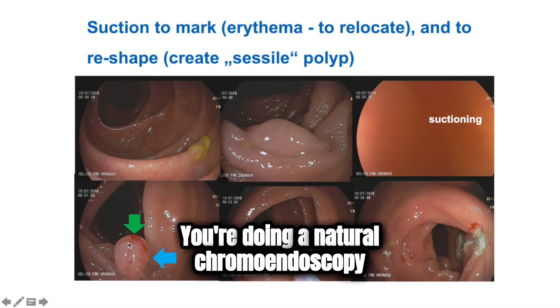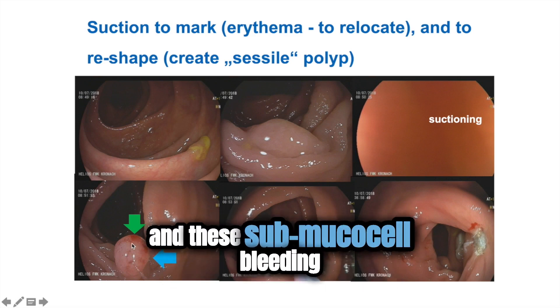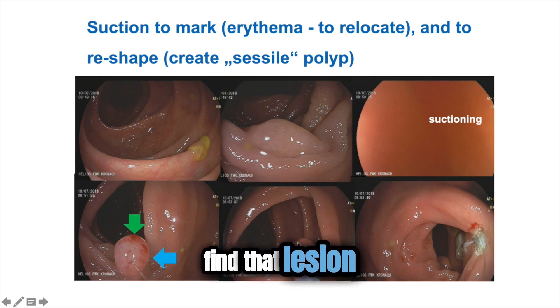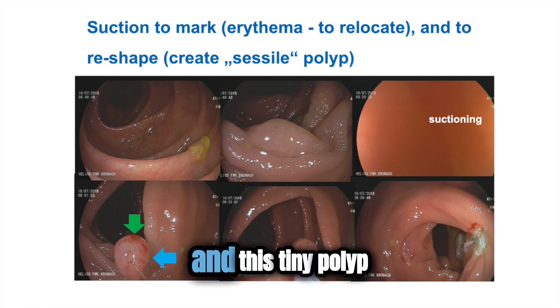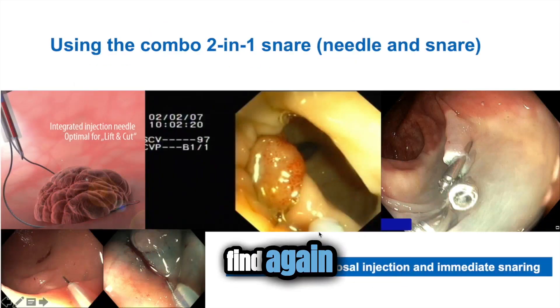You're doing a natural chromoendoscopy, and these submucosal bleeding sites allow you to find that lesion. Believe me, this technique will help you in patients who have a colon that's moving a lot, and this tiny polyp can sometimes be quite challenging to find again.